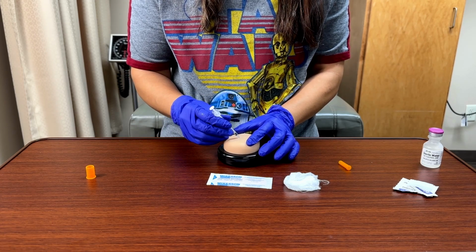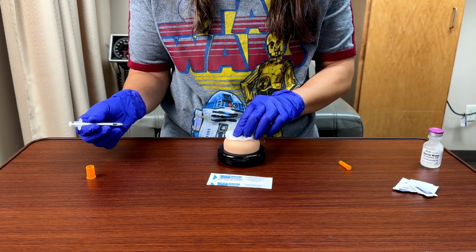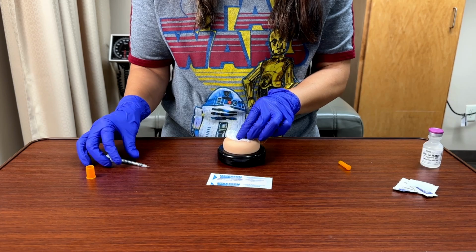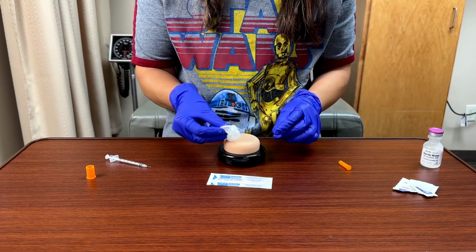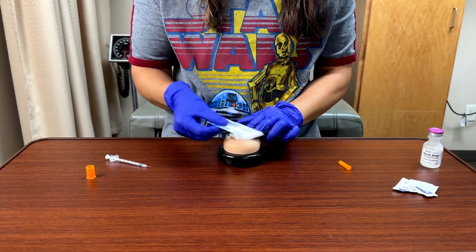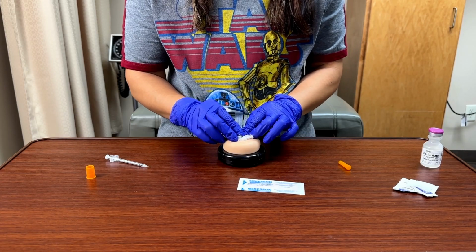Okay. Once I'm done with that, I'll remove the needle in a quick, swift motion, and I will place a Band-Aid if it's bleeding. If it's not bleeding, I can leave it open, but for this, I'm going to place this bandage, and I'm going to put the Band-Aid on like so. So that is the subcutaneous injection.